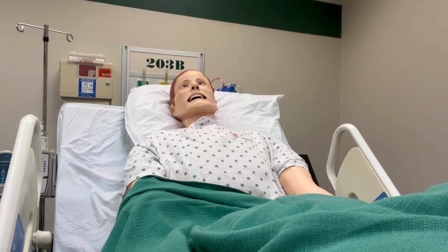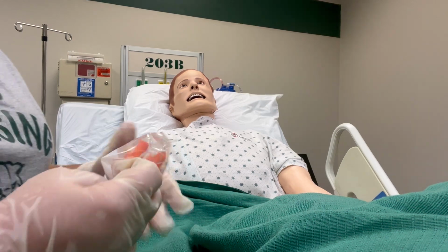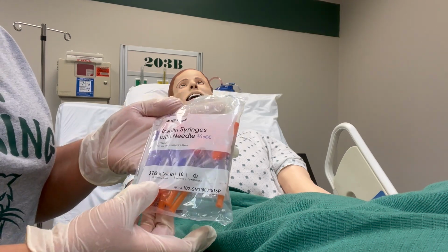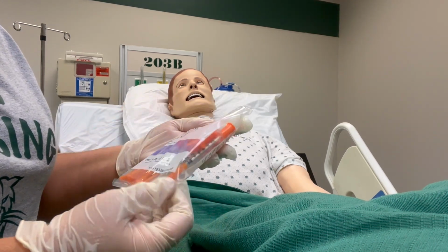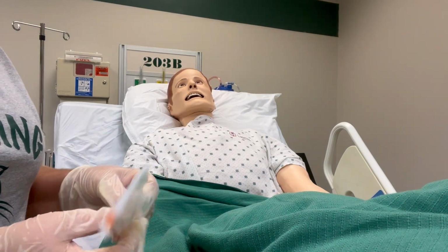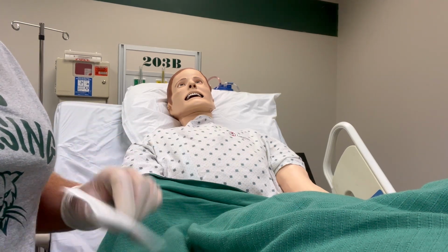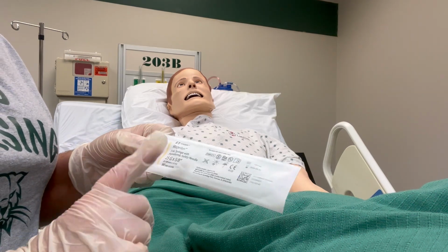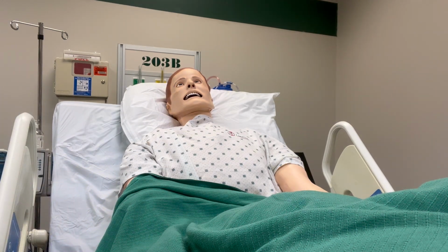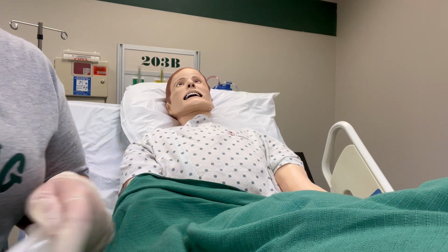I have a couple of different things here. I do have an insulin syringe. My insulin syringes come in a little bag. You can see I have a 31 gauge, 5/16 inch, and these are 30 units. I have a 1 ml, 25 gauge, 5/8. And then I have another 25 gauge, 5/8, but this one's a 3 ml. Generally, you're not going to use more than a 1 ml syringe. Now, you can use the 3 ml to draw up 1 ml if necessary, right?